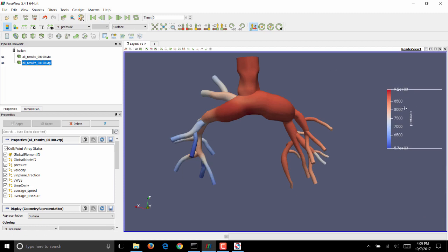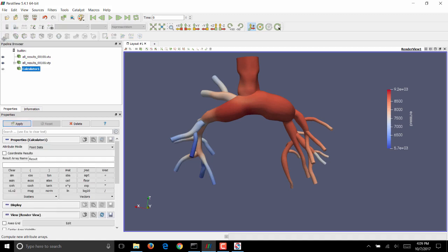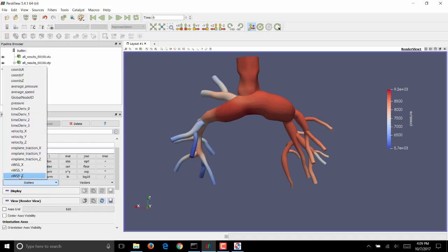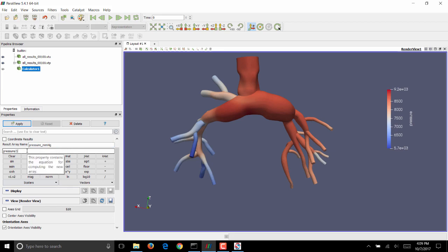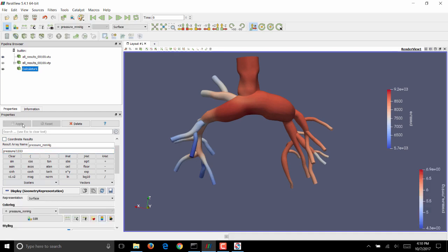To convert them to clinically relevant quantities so that it's easier for interpretation, we'll use this calculator filter. The new result, which I'll name as pressure_millimeter mercury, is pressure divided by 1,333, which is the conversion factor from dyn per centimeter squared to millimeter mercury. Click on Apply.